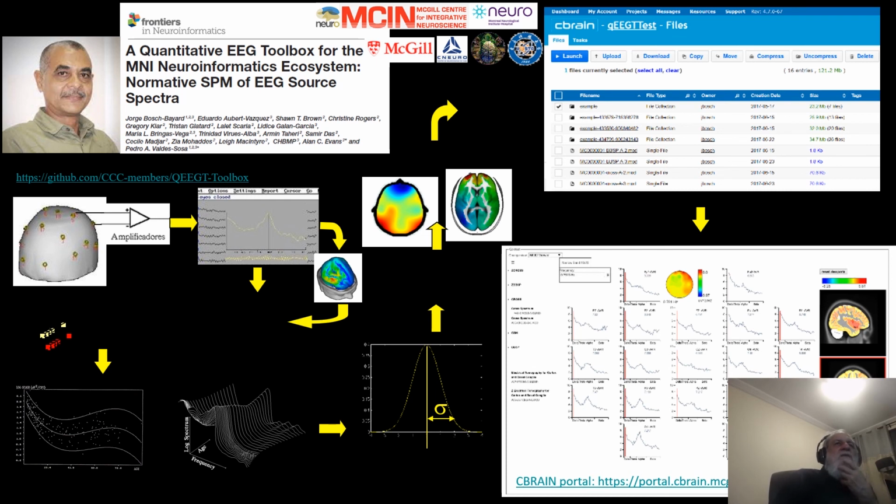So for the first wave of the Cuban brain mapping data, that's totally open, as is the second wave. But this is only EEG cross spectra. And also we've developed software to do both surface and source quantitative EEG analysis using frequency analysis. This is also on GitHub.